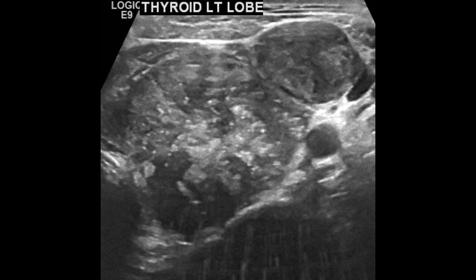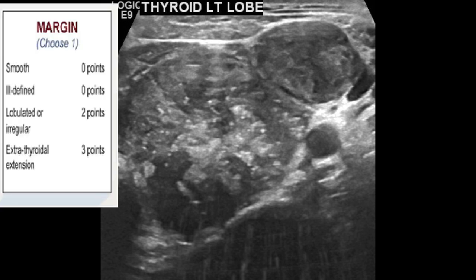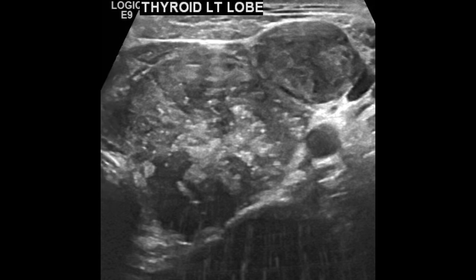Now we look at the margin. We have a smooth or well-defined margin, so we will give it zero points for that. Sometimes you may be unsure whether the margin is smooth or ill-defined, but there is no need to worry because both will have zero points — just choose one and move on.